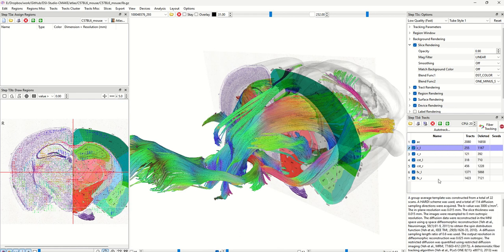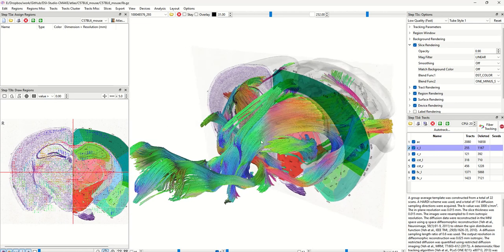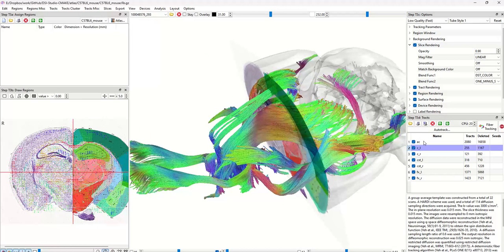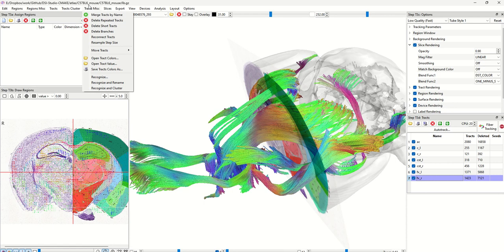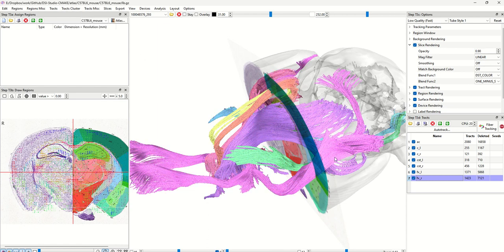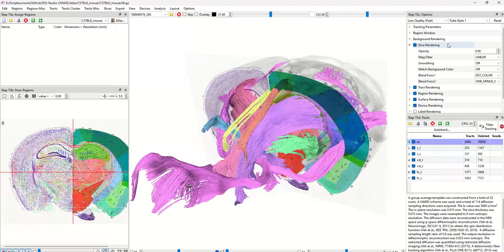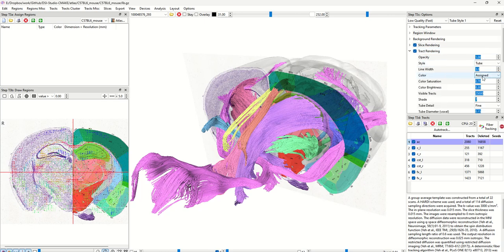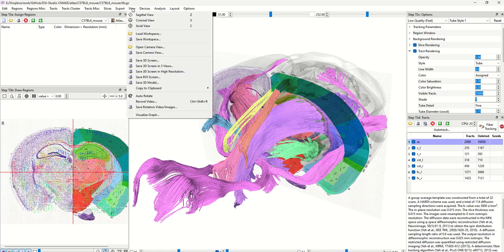Once everything looks good, you can visualize all the tracks. Another important thing to note is that the 3D model imported in PowerPoint cannot visualize the RGB directional color we see here. What you need to do is change this to Assign Color — assign a different color to each track. There's a function under Track Cluster called Assign Colors to All Clusters. Once you click on it, the track rendering switches to assigned color and each track gets a different color. For the 3D model to be supported in PowerPoint, you can only use the Assign Color mode.